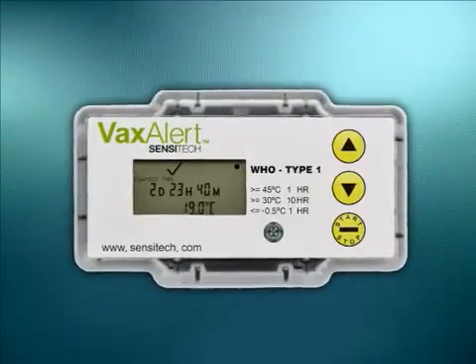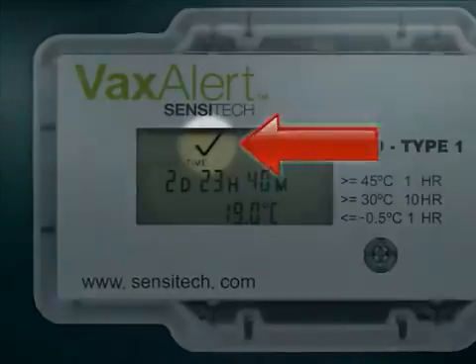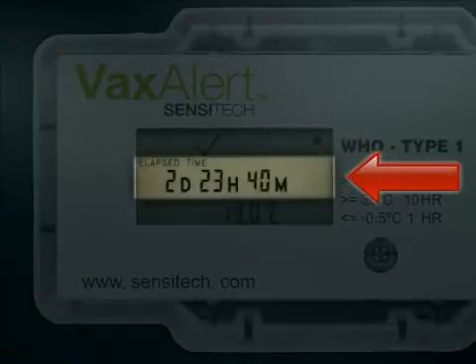If the shipment has been maintained at the proper temperatures, no alarm violations will be recorded, and a check mark will appear in the middle of the screen. The total elapsed transit time will be displayed under the check mark. In this example, a transit time of 2 days, 23 hours, 40 minutes is displayed in the middle of the screen under the check mark sign.